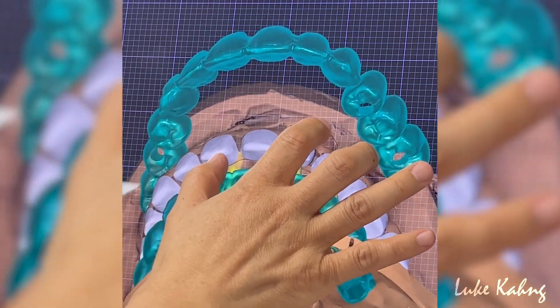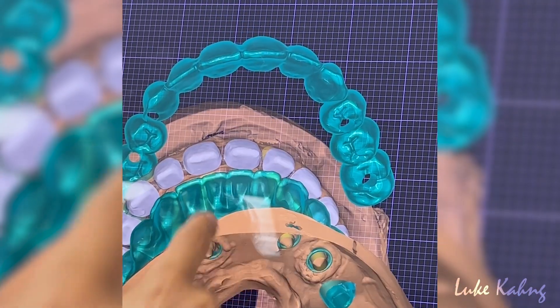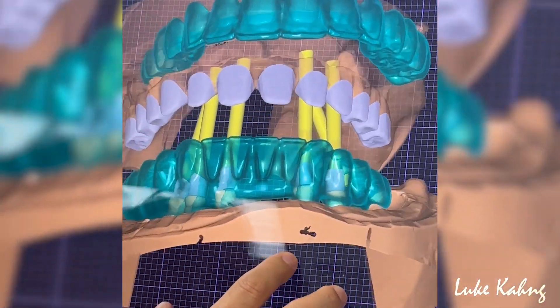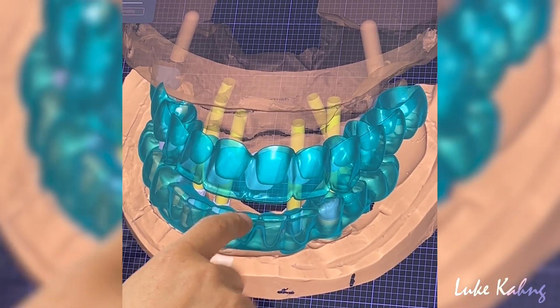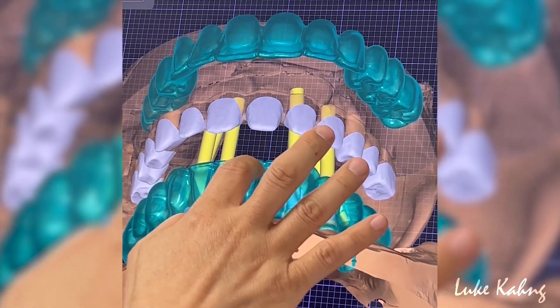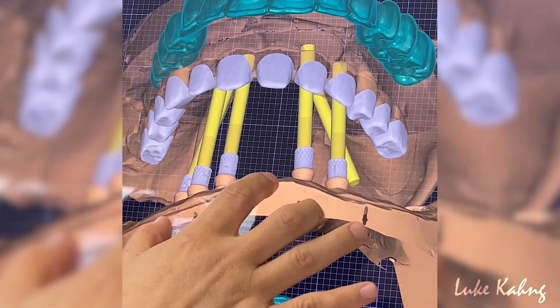This is finished — this layer. Trying to make a nice, same shape and color. And this is the implant design. This is another beauty.